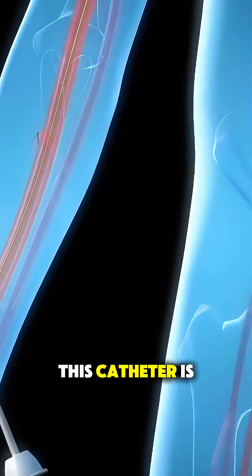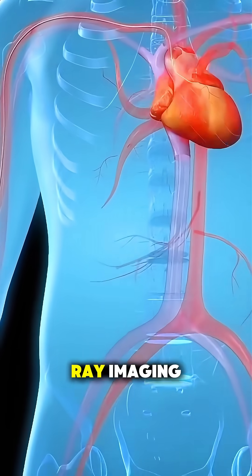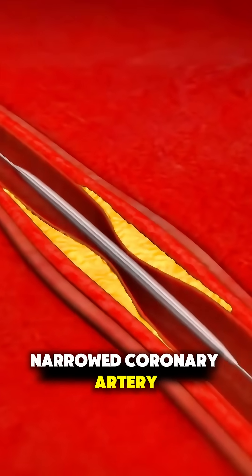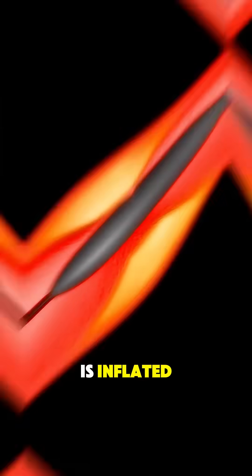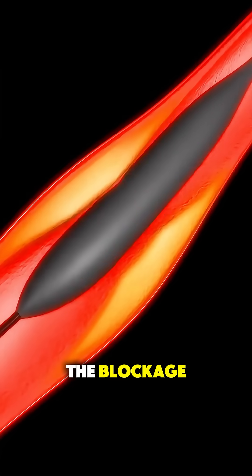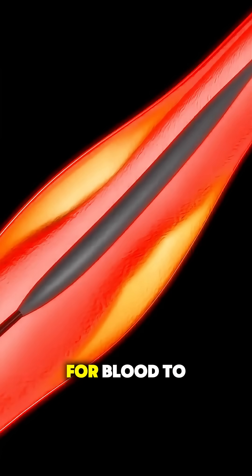This catheter is carefully guided through the arteries all the way to the heart, using live X-ray imaging. Once it reaches the blocked or narrowed coronary artery, a tiny balloon at the tip of the catheter is inflated. This balloon pushes the plaque — the fatty deposit causing the blockage — against the artery walls, clearing the path for blood to flow.